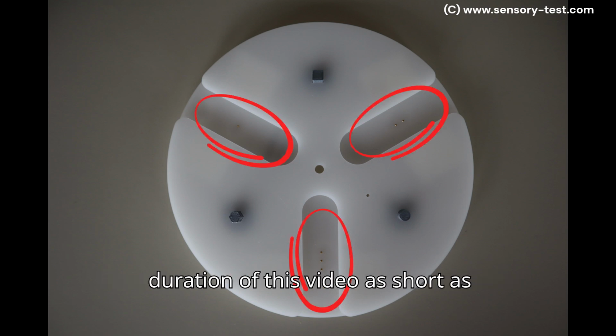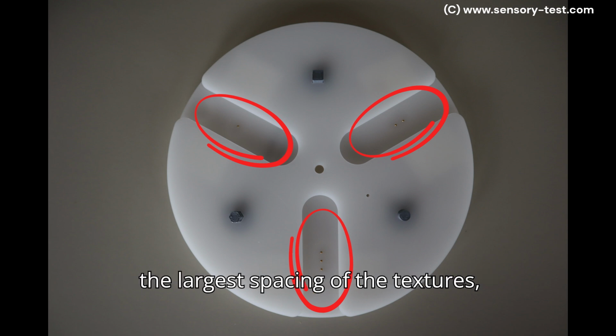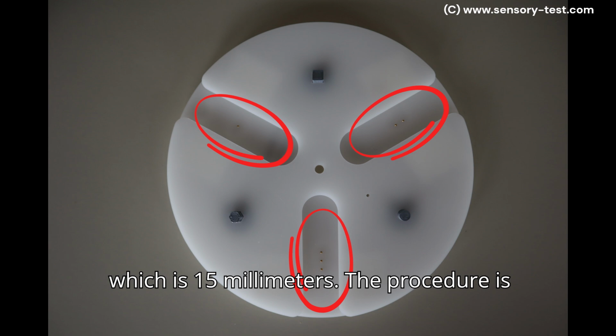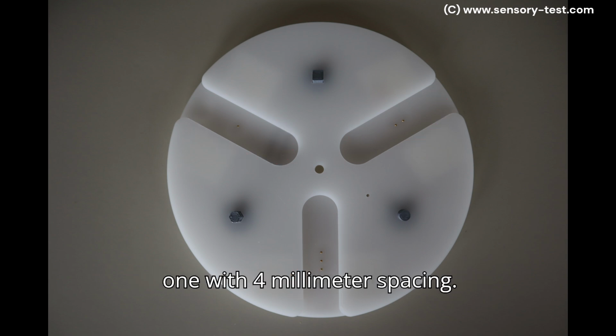To keep the duration of this video as short as possible, we will also only show how the test is administered with the disc with the largest spacing of the textures, which is 15mm. The procedure is identical with the next 2 discs, which is the disc with 8mm, and the one with 4mm spacing.